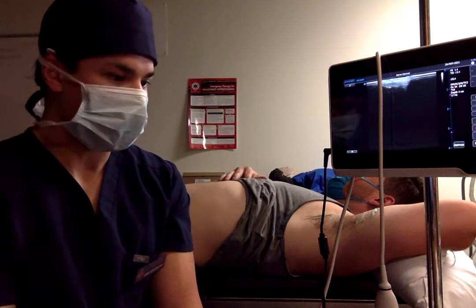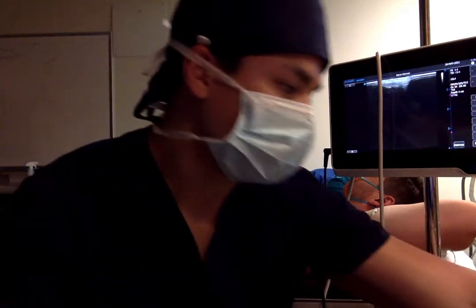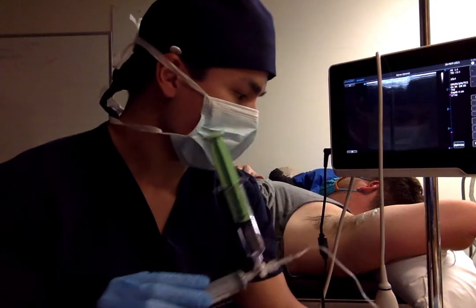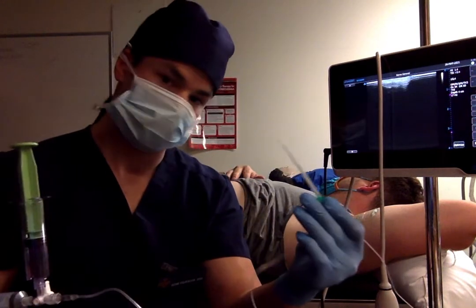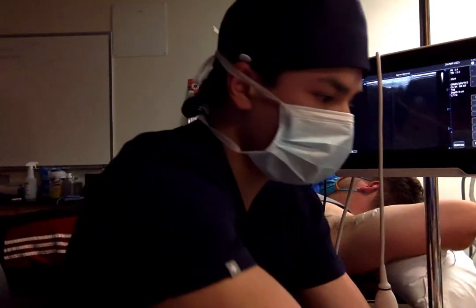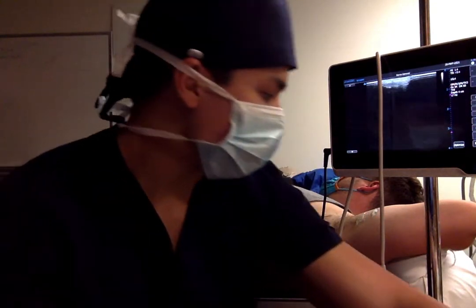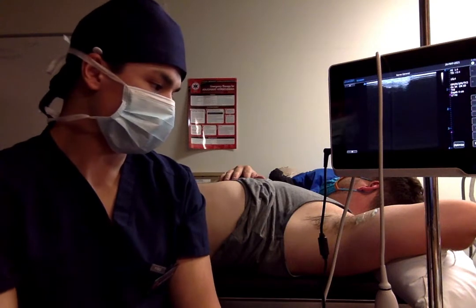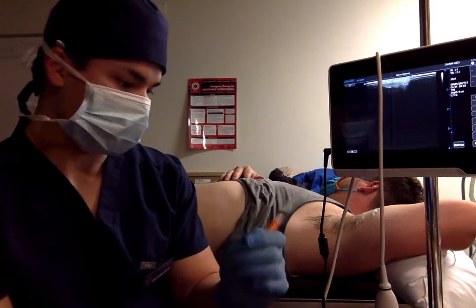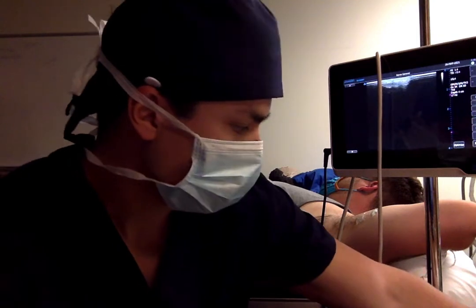All right, we fill that out. Now I'm going to gather all my supplies. I'm going to be gathering 2 syringes with a stopcock attached to my 22 gauge Stimuplex needle. That's going to allow me to use a peripheral nerve stimulator as well. I want 0.25% ropivacaine, and I'll be using sedation, so I have 2 milligrams of midazolam, and I'm going to be giving 30 milligrams of ketamine as well.